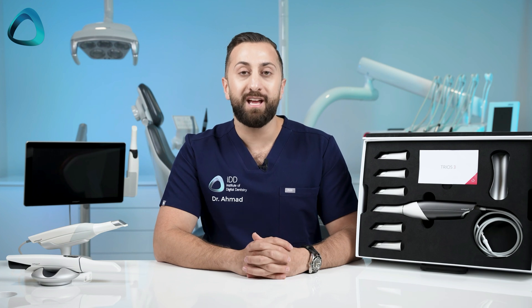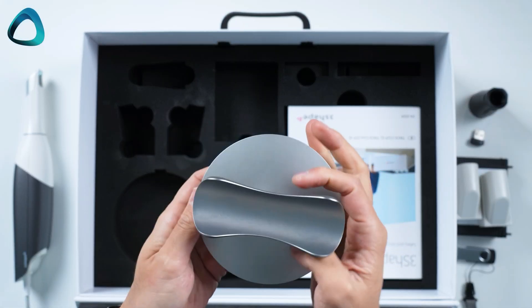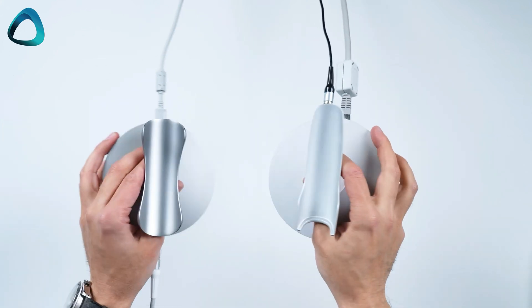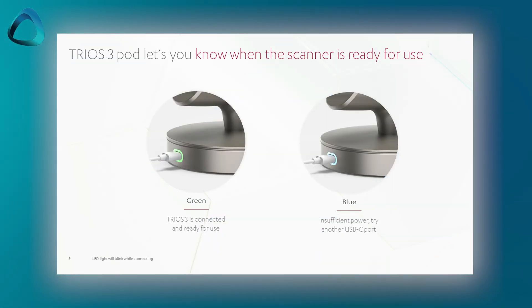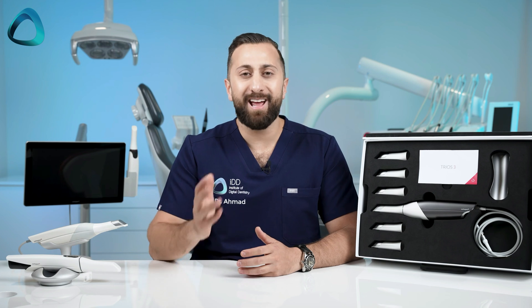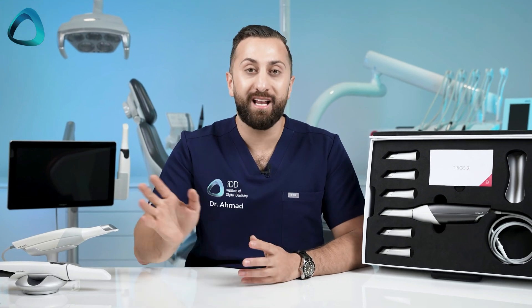The most significant changes to me are not with the scanner itself, but actually the new pod that holds the scanner. The new pod looks a lot better with a more metallic design. It is also smaller than the previous generation pod by 10% and 30% lighter at 510 grams, which is really useful as the older Trios 3 pod was quite a large unit. There are also LEDs at the back of the pod that light up green to clearly indicate if everything is connected properly. My personal favorite new feature is that the pod is now totally USB-C powered. It's just one connection, one wire to the laptop, and that is it.